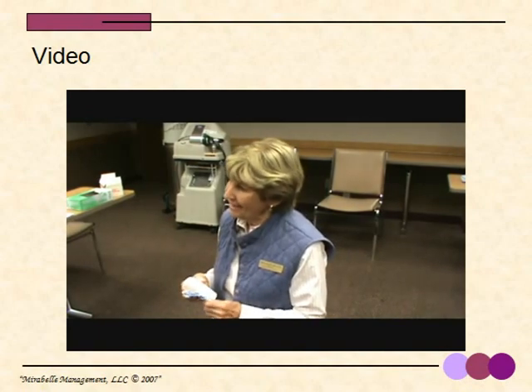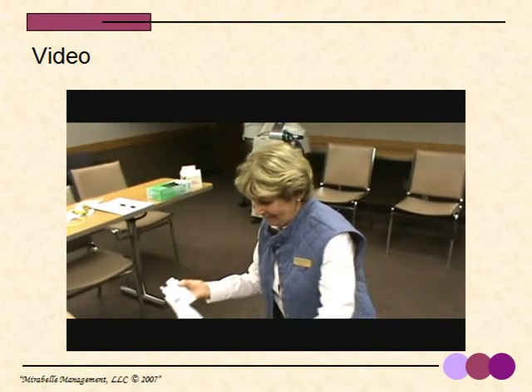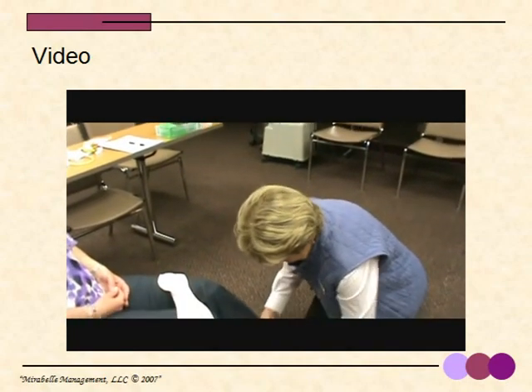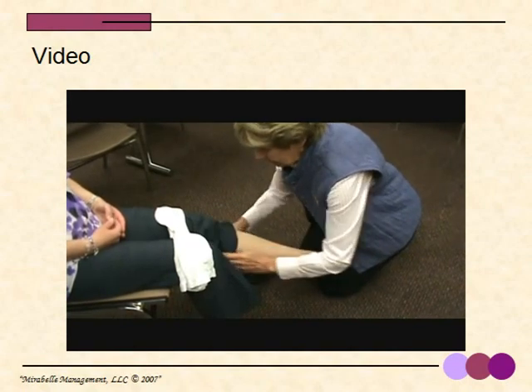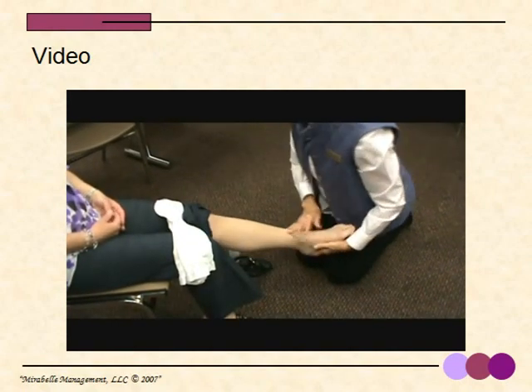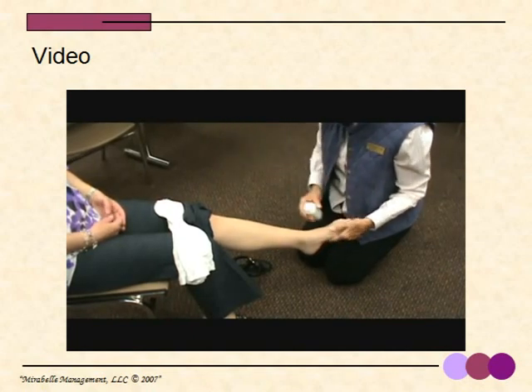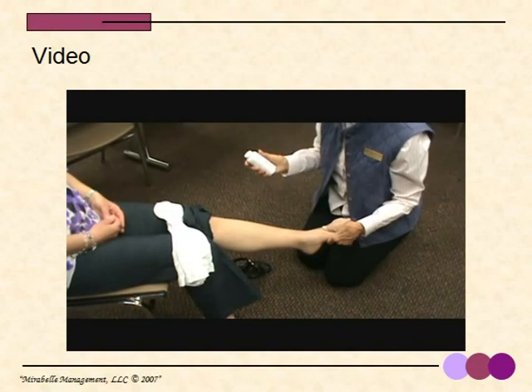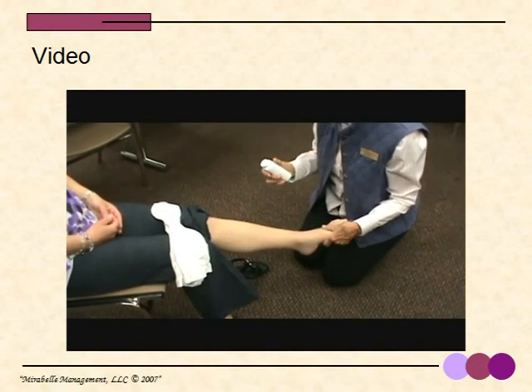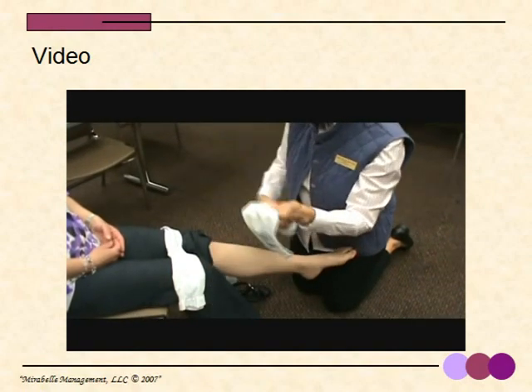Morning, Vicki. Good morning. I'm Jean, and I'm here to help you put on your TED stockings this morning. All right, we'll slip your shoe off here. Roll your leg up. Did you have a good night last night? I did. I slept very well. Good. I've got some talcum powder here that I could use, but your feet feel nice and dry, so I don't think we need to use it. Sometimes they use cornstarch, but you don't find a lot of cornstarch in apartments these days. So here's your TED stocking with a hole in the bottom.